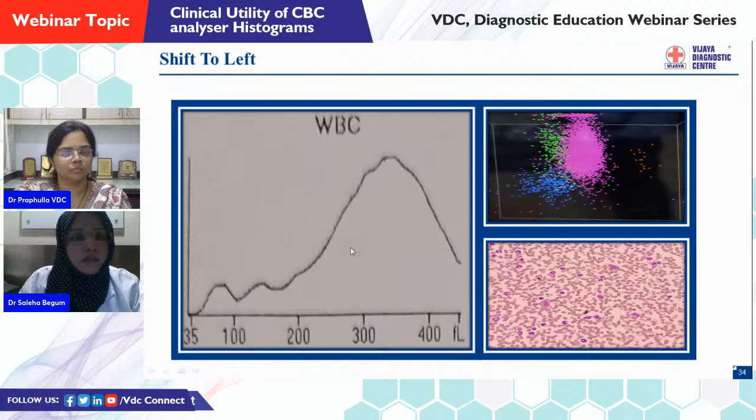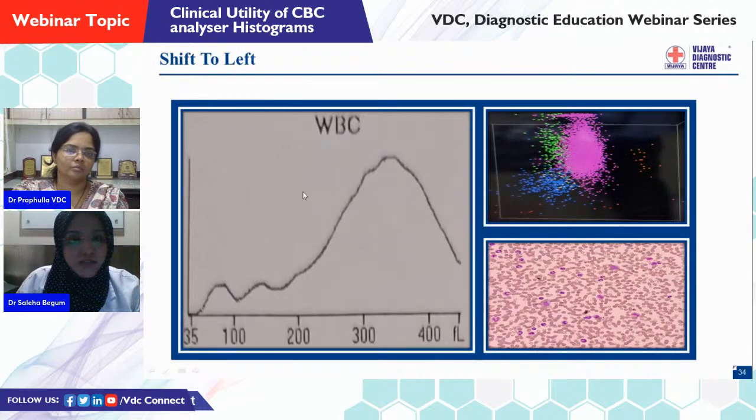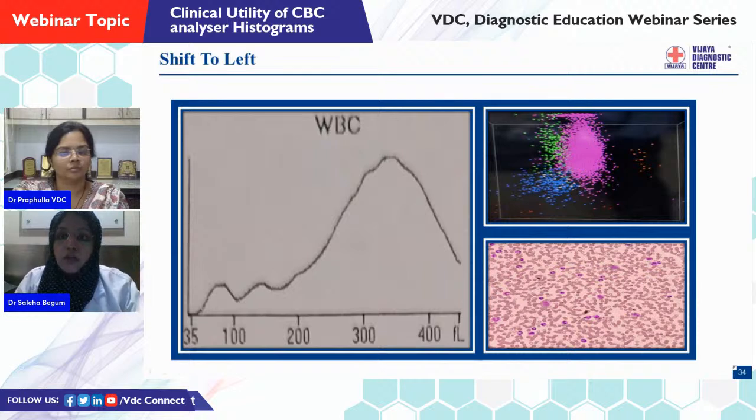So this is another example where you are seeing a broad right curve and no lymphocyte curve, and there are small bumps in the mid cell population. So this is a shift to left in the patient blood, not in the graph. The graph is shifted to right here. So in the peripheral smear, you can correlate the immature granulocytes, the myelocytes, the metamyelocytes, and band forms. And in the scattergram, the dense purple population is representing a shift to left. That means immature granulocytes are present. This could be a case of anything: leukemoid reaction, chronic myeloid leukemia, anything. So basically, whenever the patient is having leukocytosis with shift to left, we get to see these patterns.